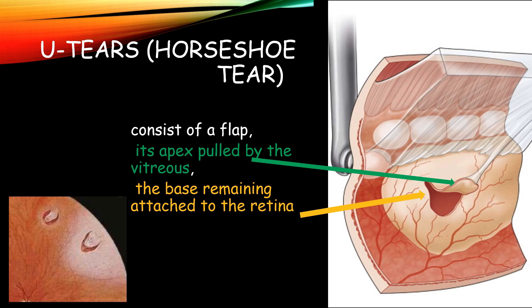The first lesion I will discuss is a U-shaped tear, also known as a horseshoe tear or HST. It consists of a flap whose apex is pulled by the vitreous and the base remains attached to the retina.